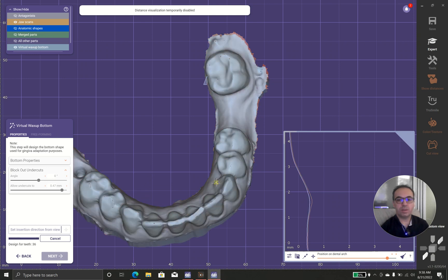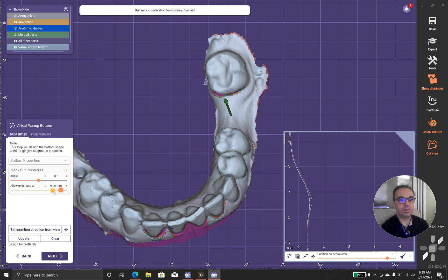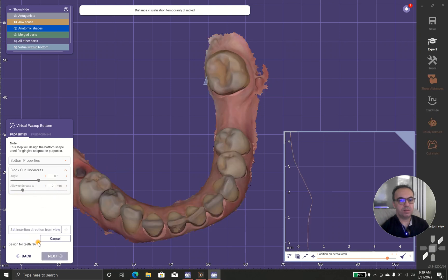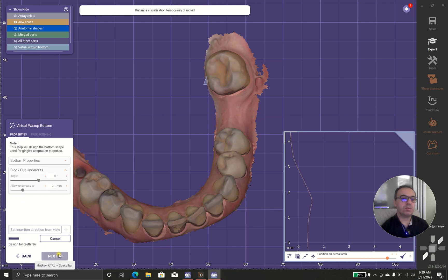So I prefer 0.1 and the angle 0 and update. It depends on your needs.